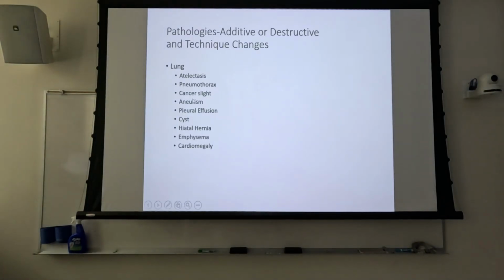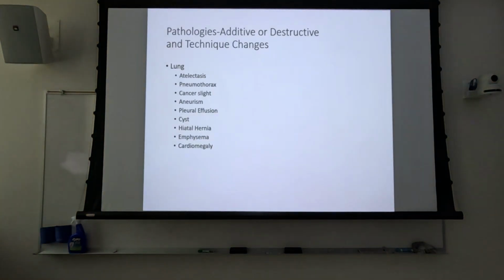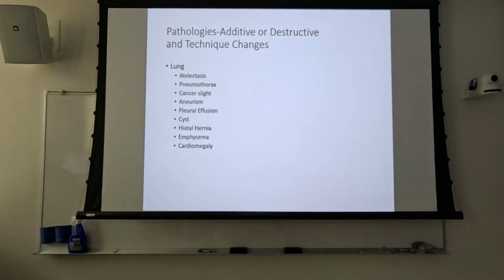Bone cancer goes the other way though. With bone cancer, you've got eating away of the cortex of the bone. Bone cysts look like bone cancer, but you can still see the cortex. So you shoot an image on somebody and you might even have some deformation in the bone, but if you can still see a semi-well-defined cortex, then chances are that's a bone cyst.